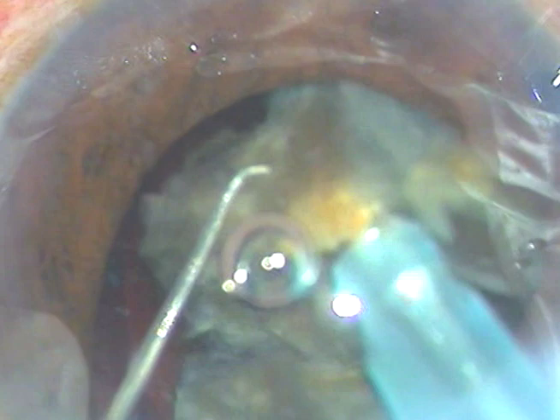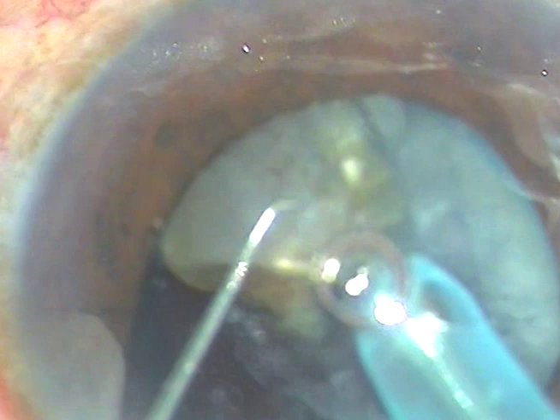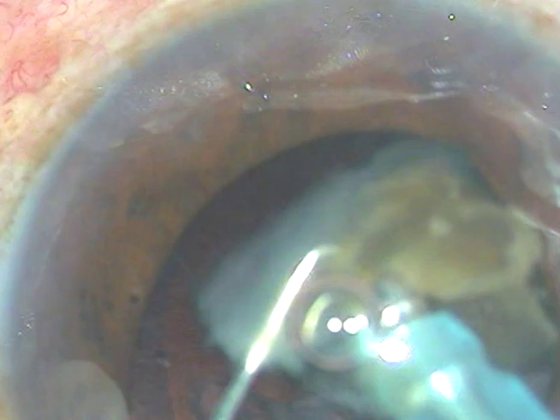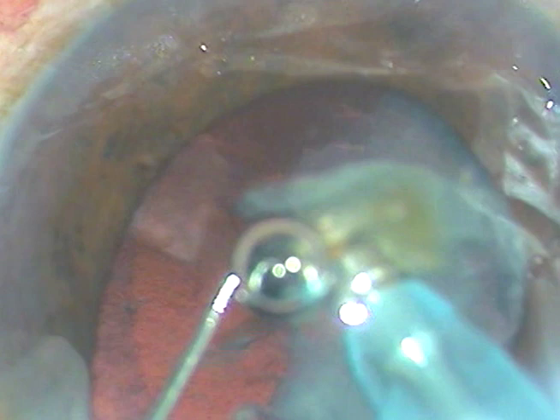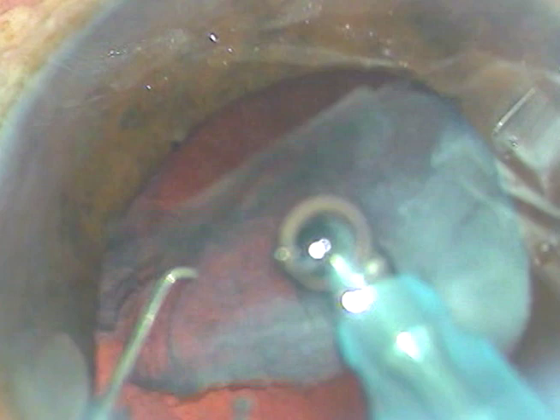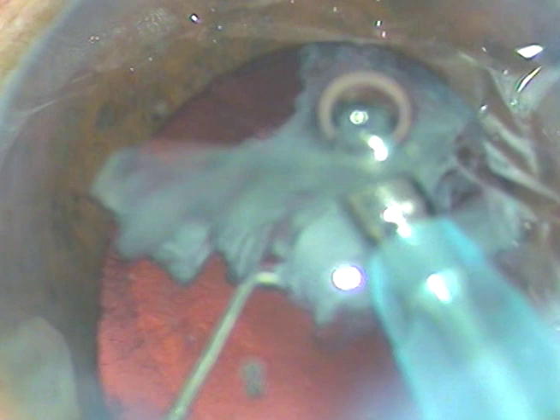I go into the anterior chamber again, apply ultrasonic power, and remove the middle piece. With hard cataracts, when we take adequate precautions, posterior capsular rent is not very common, because we keep our intuition alert all the time, keep the anterior chamber formed, and take care of the stability of the anterior chamber. These precautions don't cause PC rent frequently. Now this is the management of the epinucleus.